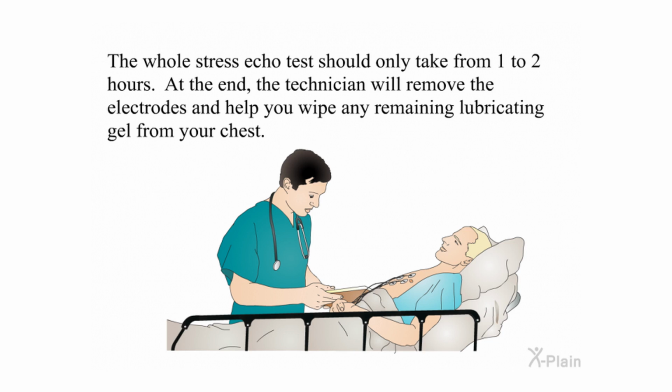The whole stress echo test should only take from 1 to 2 hours. At the end, the technician will remove the electrodes and help you wipe any remaining lubricating gel from your chest.